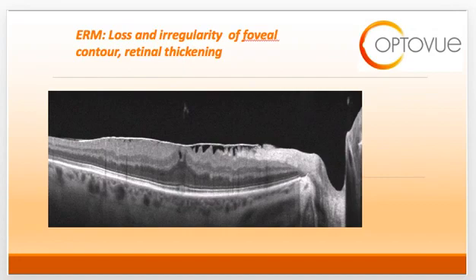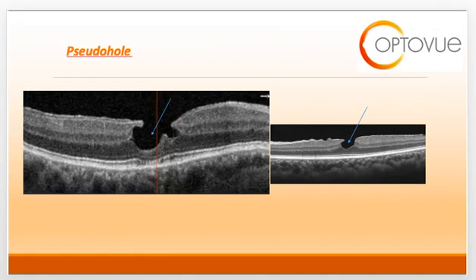Another finding from chronic ERM or strong ERM forces is a loss of the foveal contour. On this slide there is a complete absence of the foveal pit with overall retinal thickening and those sawtooth formations of the ILM adherent to the epiretinal membrane. The pseudo-hole is another type of partial thickness hole associated with an epiretinal membrane. It is partial thickness because there is still residual healthy outer retinal tissue present, and it is usually a complication of epiretinal membrane formation.